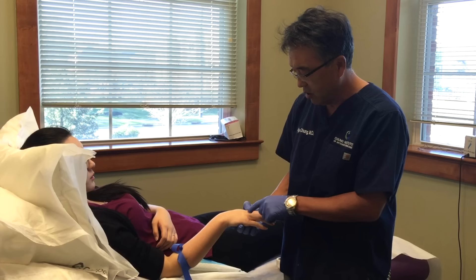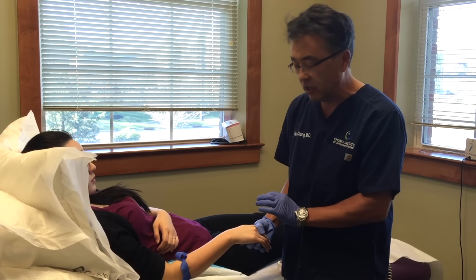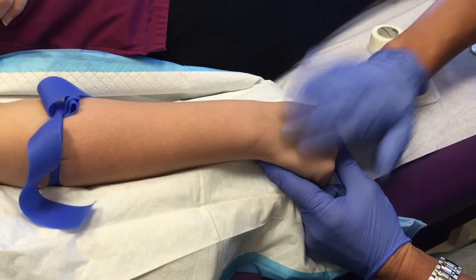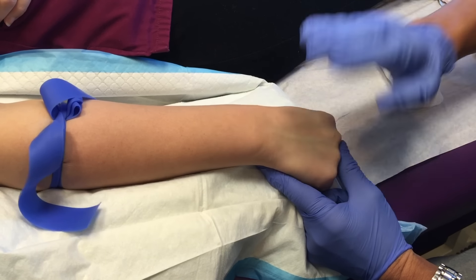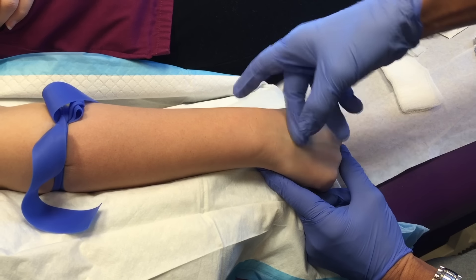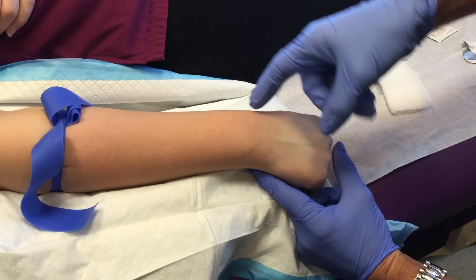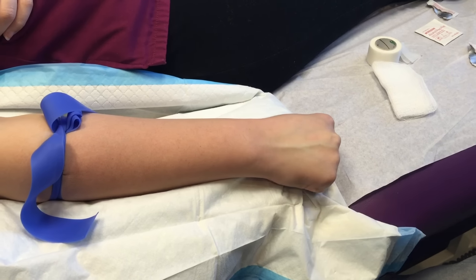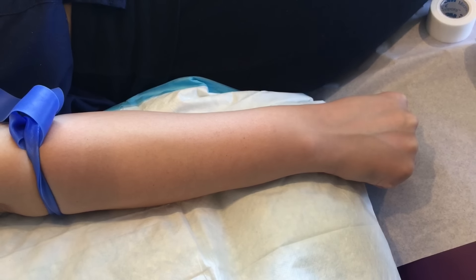Today I'm going to demonstrate on the hand mainly because on the video you can see the vein so well on this patient. I find that tapping makes the vein stand out more — even veins have a little smooth muscle on them so they can constrict. By tapping you will make the vein stand out, as you can see.